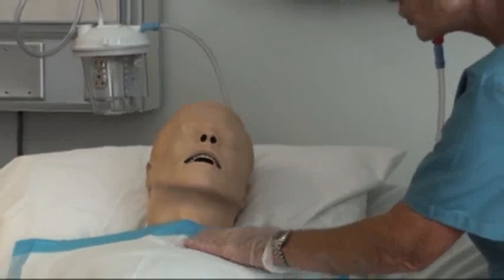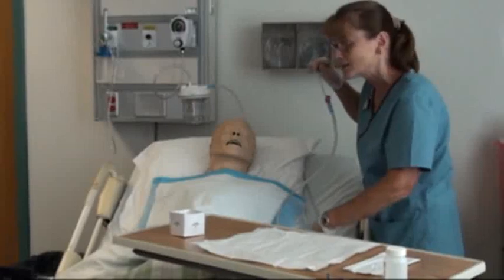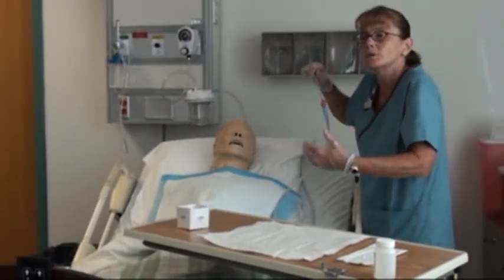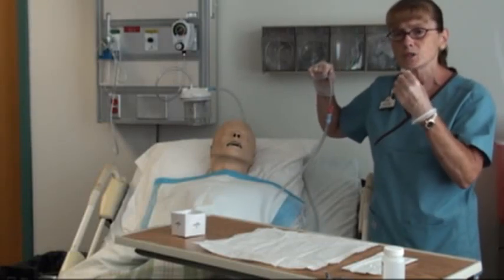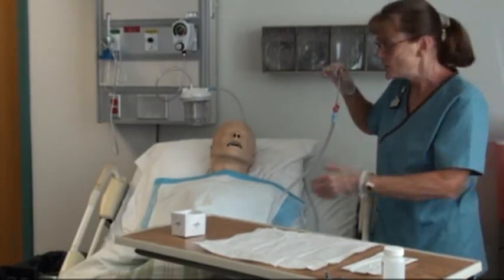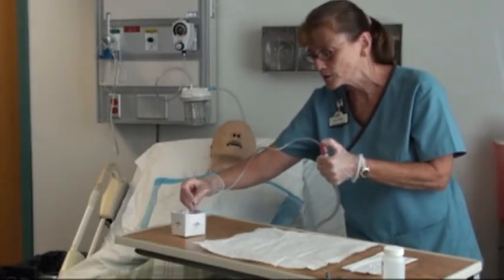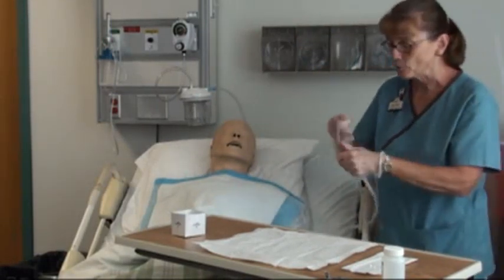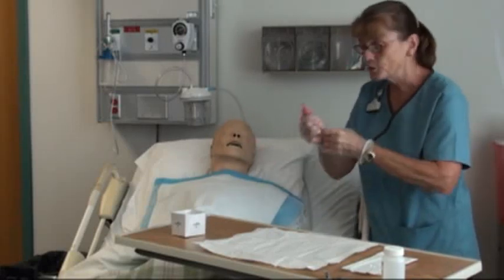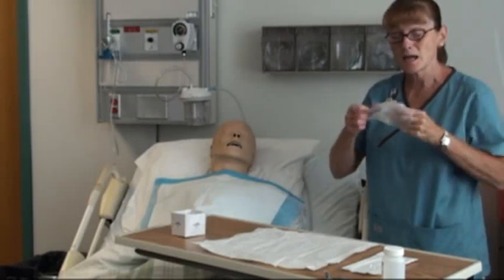I'm following it down. Roll it around your hand keeping it sterile. Talk to her, reassure her, check her pulse. Look at her skin color and get her to take slow, deep breaths — sometimes you have to talk them down and get them to relax. Because not only are we suctioning out their secretions, but we also suction out their oxygen when we do this. Reassure them. She's sounding better and thinks she's doing better as far as the secretions. Suction this all the way out, then wrap the catheter around your hand or your glove over top of it so all the secretions are contained within it.